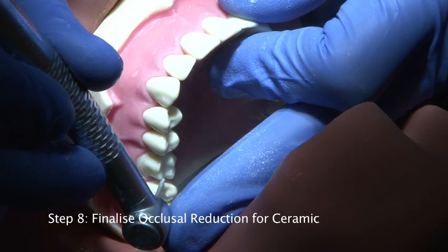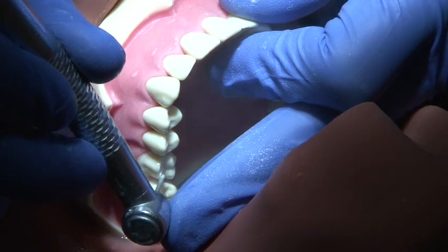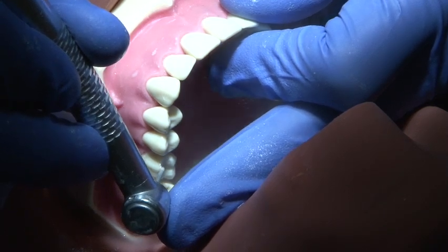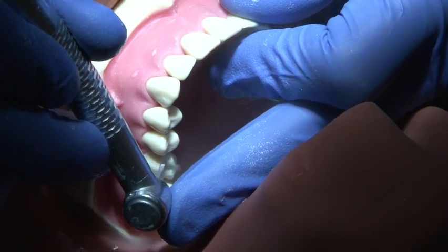The buccal cusp is then finally prepared to a total depth of 2mm to allow for the use of ceramic material on the buccal cusp slope. The outline of the cusp inclines is followed to maintain resistance form.